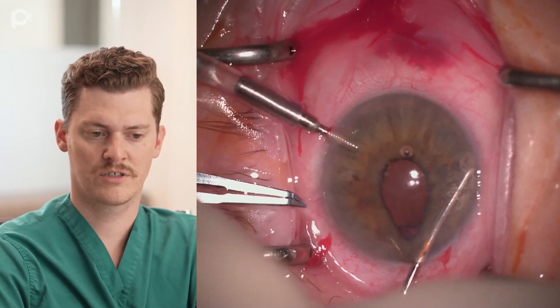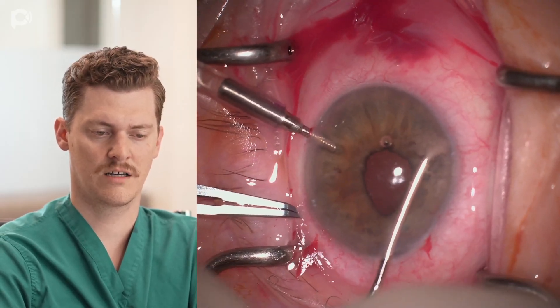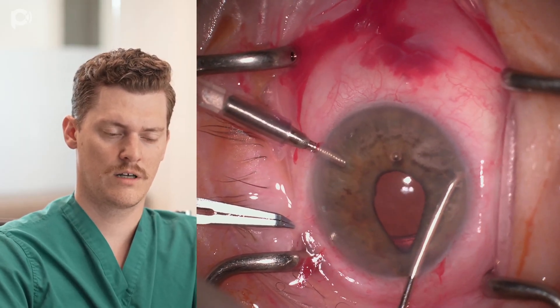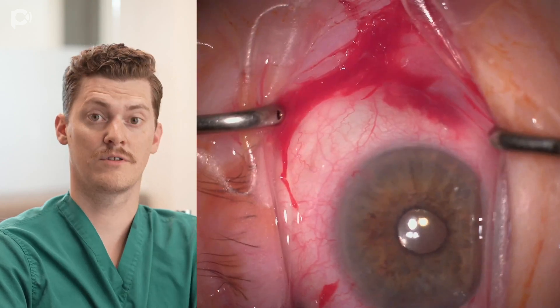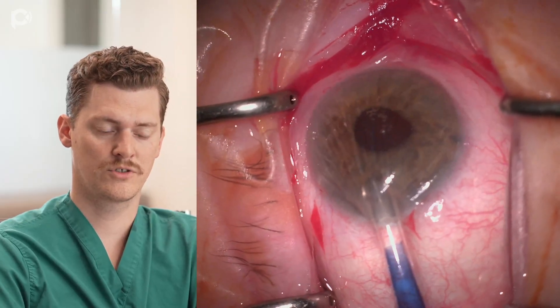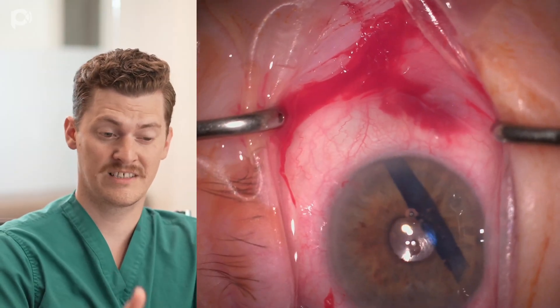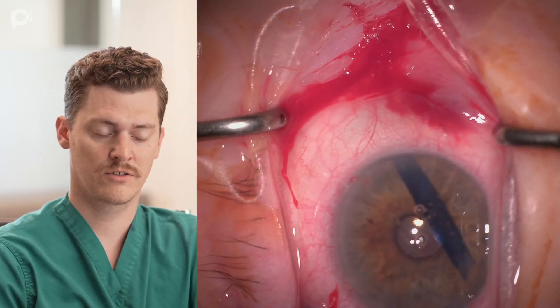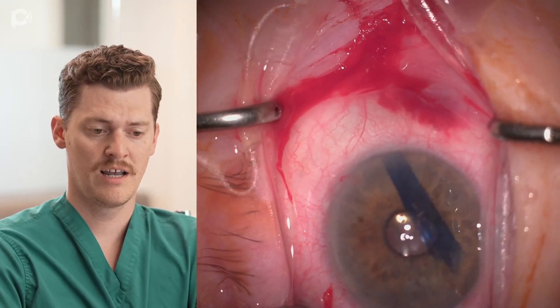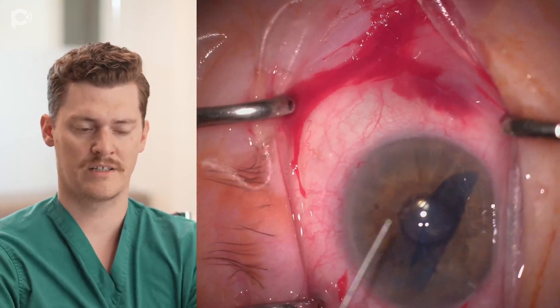We make our PI intraoperatively so we don't have to do it at a laser preoperatively. You can see the bubbles forming — that's a sign that it's cauterizing the iris. After I feel comfortable with how much of a PI I've made, I remove the thermocautery device and proceed with the surgery. Before I inject the graft, I make sure the chamber is deepenable so that we can manipulate the eye as needed during graft unfolding. Here I inject the graft. I can see it's in a single scroll pattern, really tough to tell the orientation, so the first thing I'm going to do is remove some of the air bubbles from the eye so they don't interfere with graft unfolding — that's paramount.